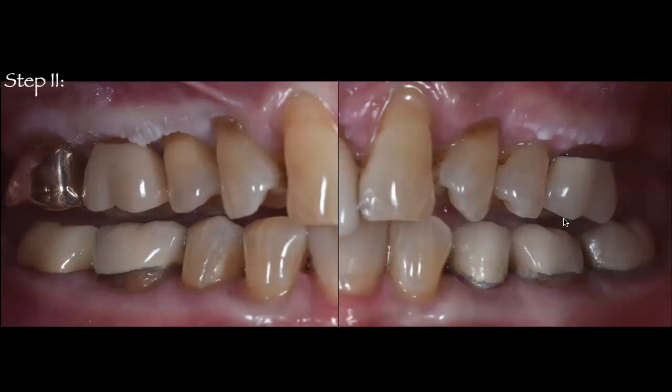Now, for this particular case, I am going to redo all the ceramics. In this patient, we had to extract 2 teeth, these premolars were extracted, and some implants were placed there. So we're going to do a full mouth rehabilitation. I'm going to wait 8 to 10 weeks, and regardless of whether I obtain full contact between these teeth, I'm going to start removing those crowns and putting my temporaries on. But that is not what I want to convey today. My goal today is to show how to use these prototypes to segmentally increase the vertical dimension and allow these teeth to intrude and extrude until you get to full occlusion.